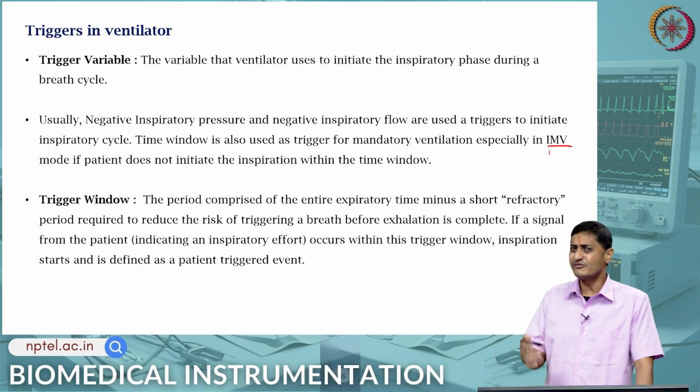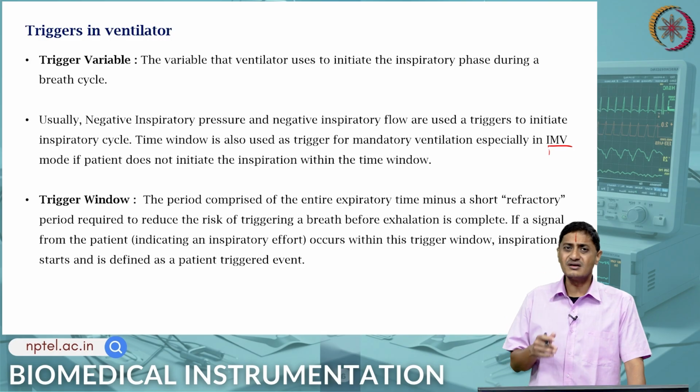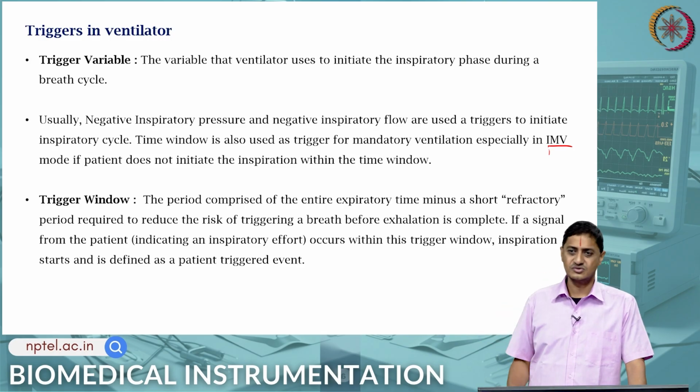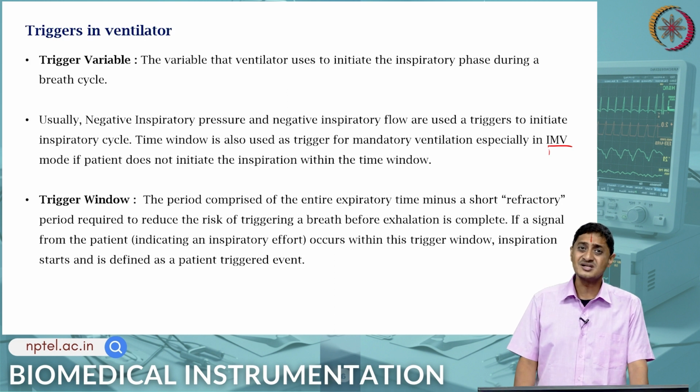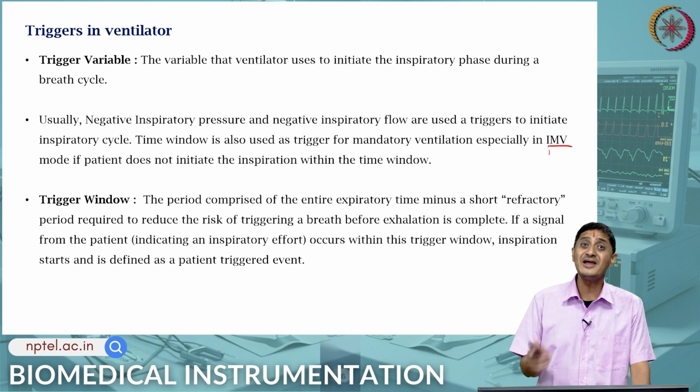By the way, there are different forms of breath, you can breathe very fast or you can breathe very slow. So, there are different rates at which this can happen. So, inspiration starts if the patient has given a trigger, and then this is a patient triggered event.